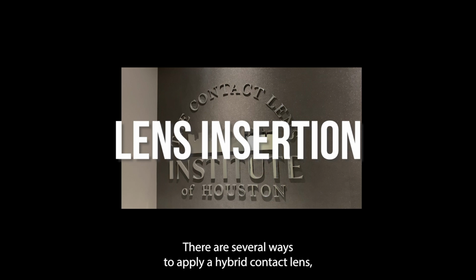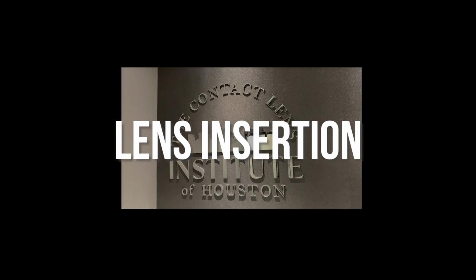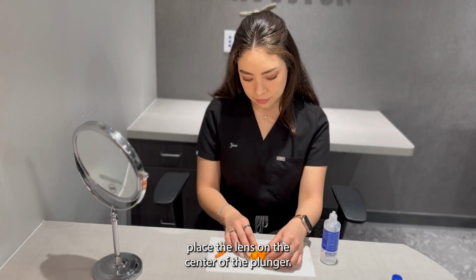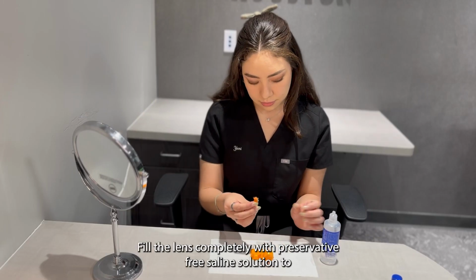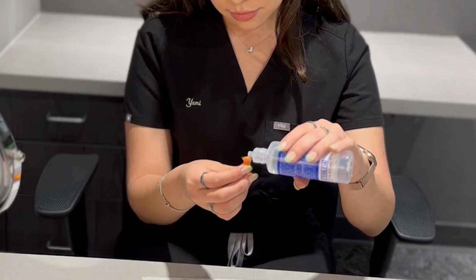There are several ways to apply a hybrid contact lens, but we will cover the two most common in this training video. The first method involves utilizing a large plunger. Place the lens on the center of the plunger. Do not squeeze the plunger to create suction. Fill the lens completely with preservative-free saline solution to avoid an air bubble.